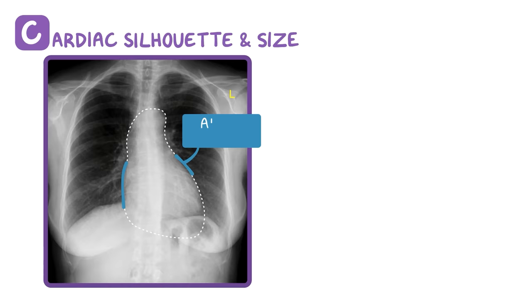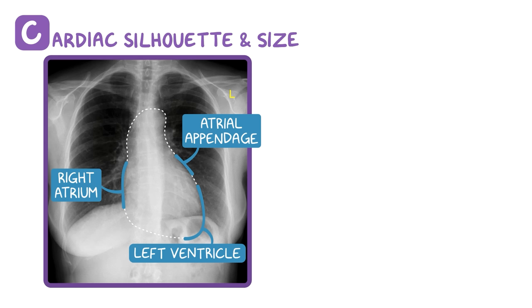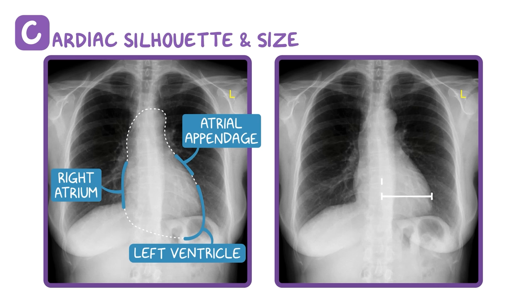C is for cardiac silhouette and size. This is the cardiac silhouette, and there's an atrial appendage, the right atrium, and the left ventricle. Remember, in chest x-rays we define features relative to the patient, so the right atrium is on the left side of this x-ray, and the left ventricle is on the right side. Measuring across a normal heart is less than 50% of the greatest diameter of the ribcage measured from the inner portion of each rib. Any larger, and there may be cardiac pathology.